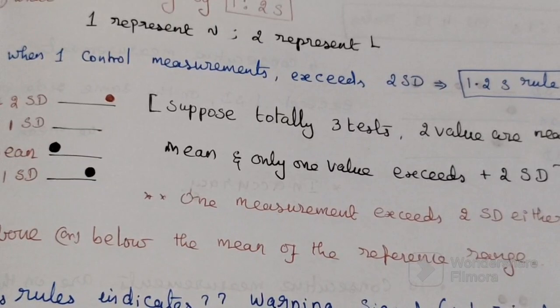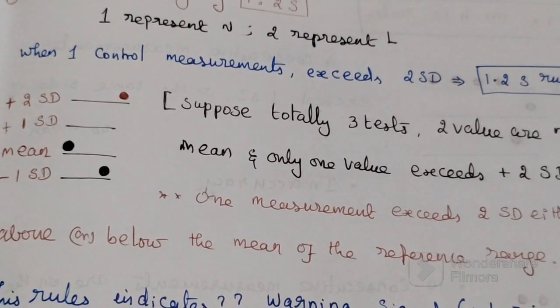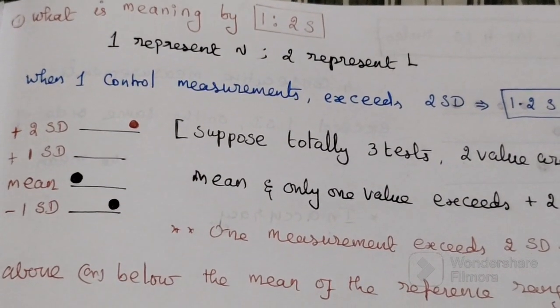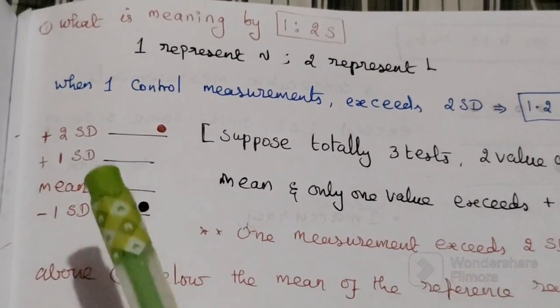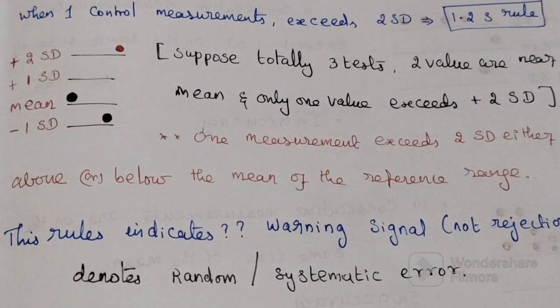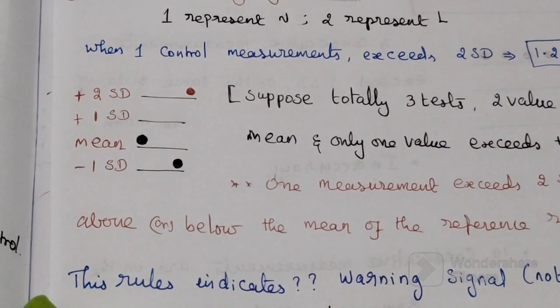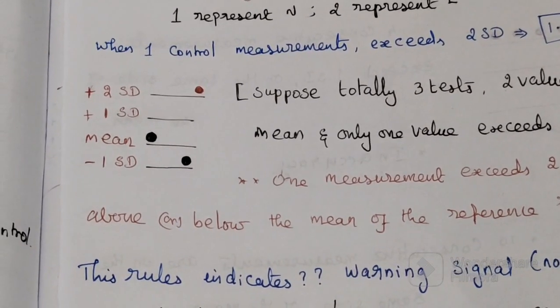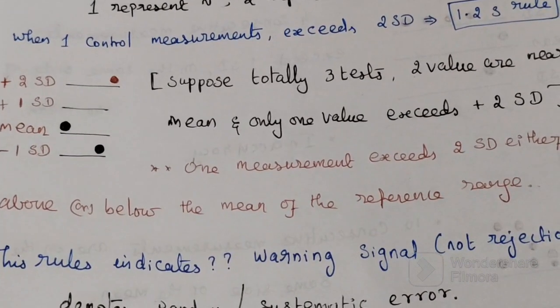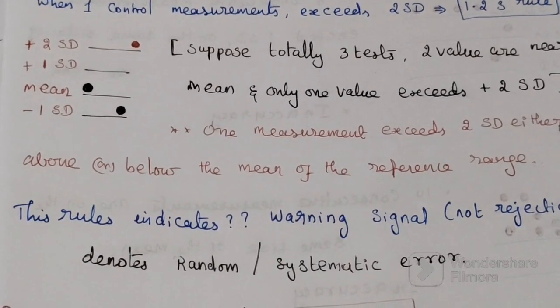So let's discuss the importance of each rule. First one is 1 2s. As already said, 1 means the number of control measurements, so here the number of control measurements is 1. It exceeds the 2 standard deviation. Here you can see 1 control measurement exceeds plus 2 standard deviation. That's why it is called the 1 2s rule. Now what does the 1 2s rule indicate? It is just a warning signal. It is not a rejection rule. And 1 2s denotes a random error or the beginning of a systematic error.